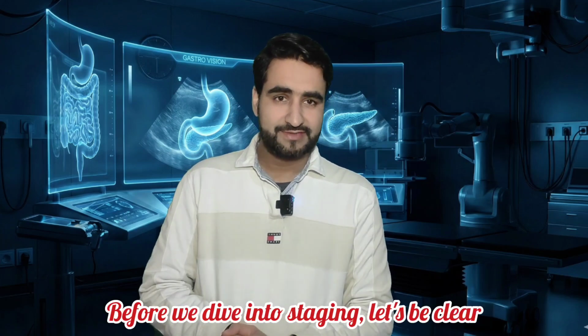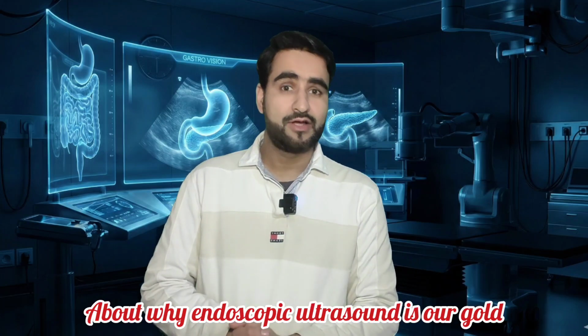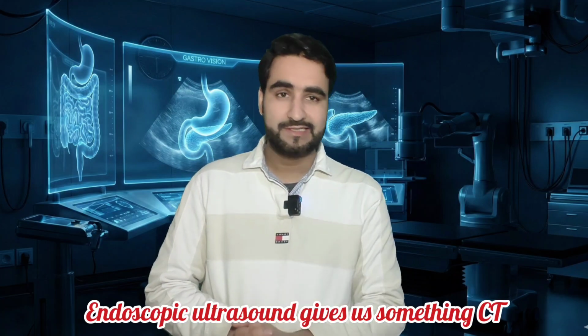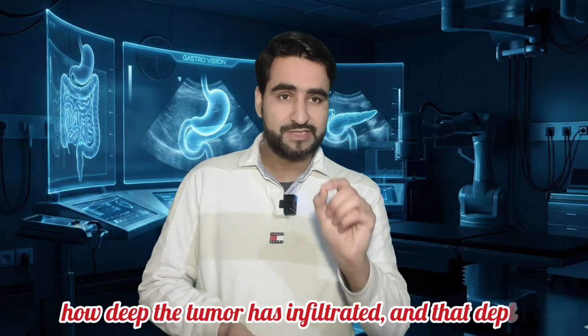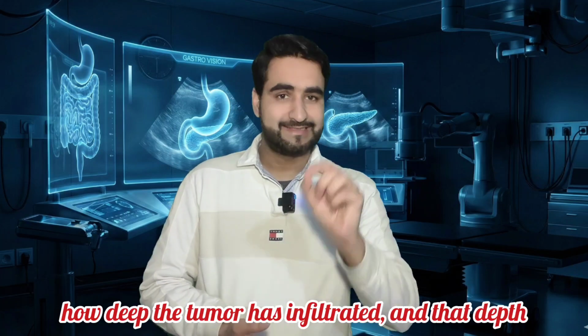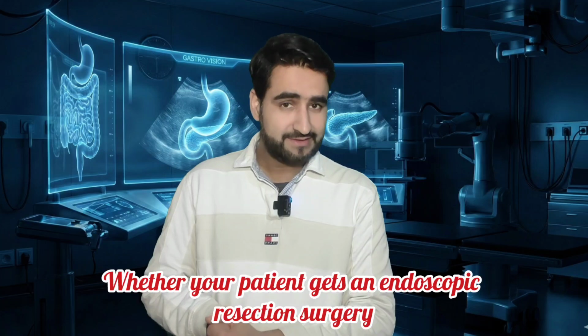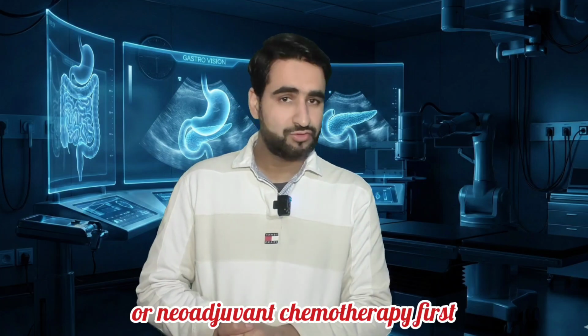Before we dive into staging, let's be clear about why endoscopic ultrasound is our gold standard tool for local staging of gastric cancer. Endoscopic ultrasound gives us something CT and MRI simply cannot: a high-resolution layer-by-layer view of the gastric wall in real time. It tells us precisely how deep the tumor has infiltrated, and that depth determines everything, whether your patient gets an endoscopic resection, surgery, or neoadjuvant chemotherapy first.